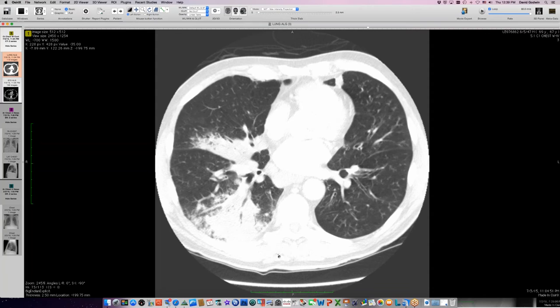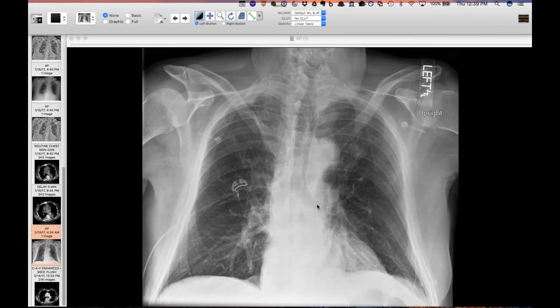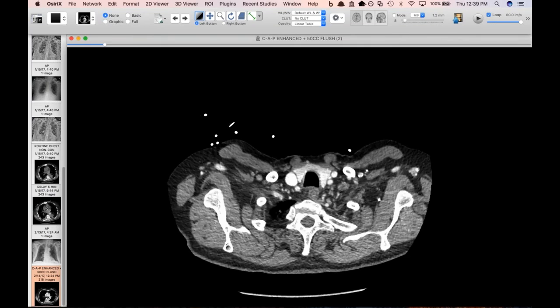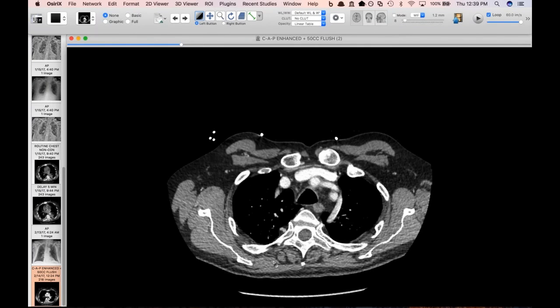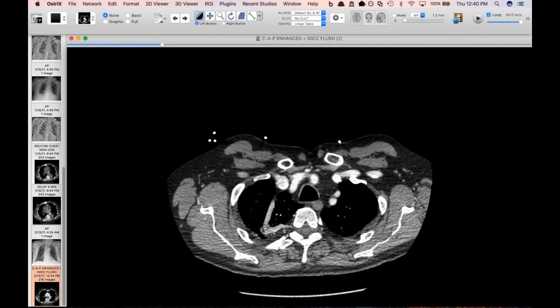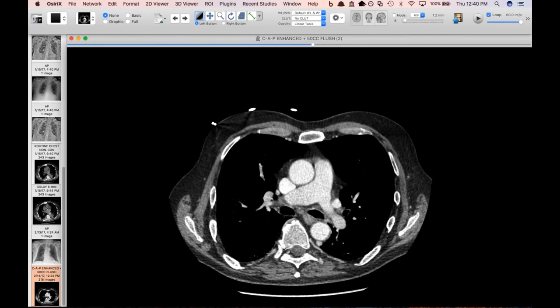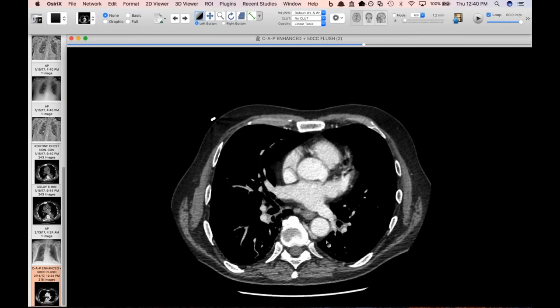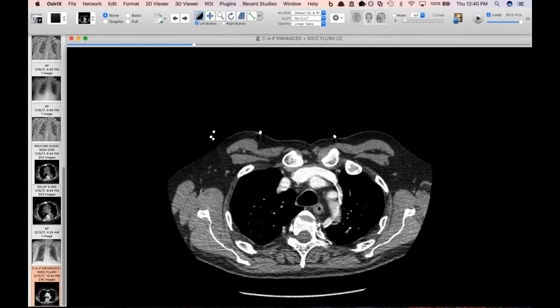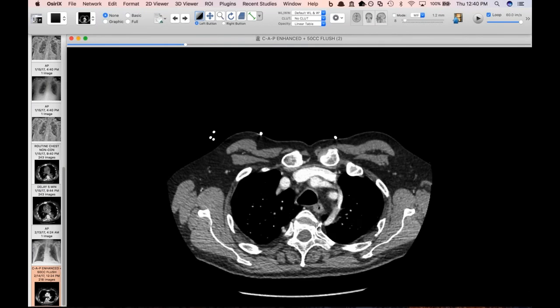I've got a hodgepodge of different things today. This is a quick one from a couple of days ago. He has an azygous fissure here — or what looks like one — and the lung was a little busy up there. But this is a variant I haven't seen: it's actually not the azygous vein in there because this vein is just a superior intercostal vein. He has no azygous vein at all. It turns into a large superior intercostal vein which then occupies this area — a variant of an azygous fissure that has a superior intercostal vein in it.